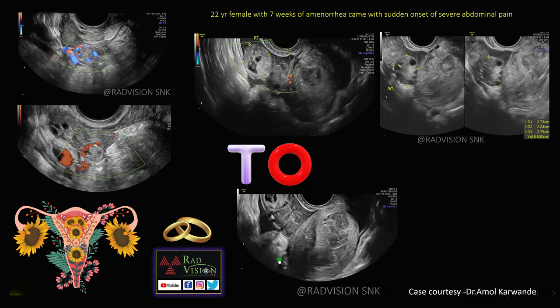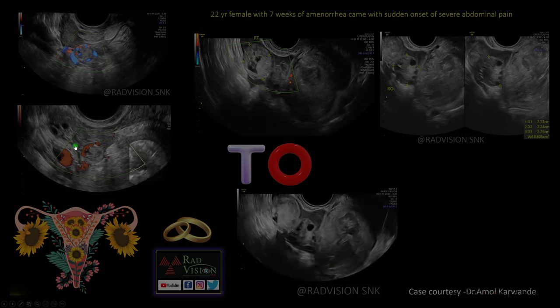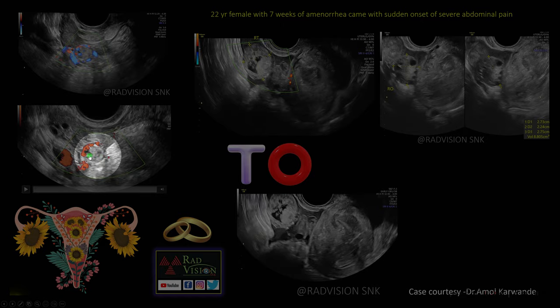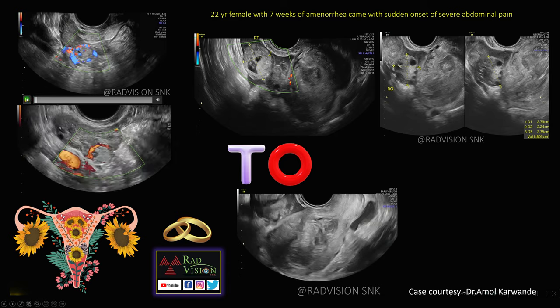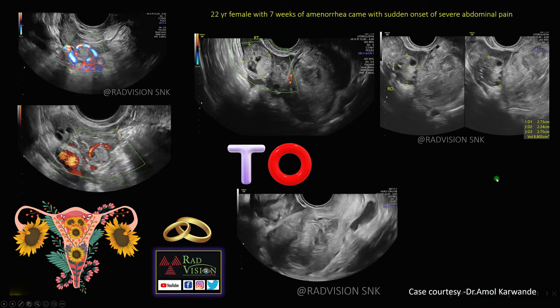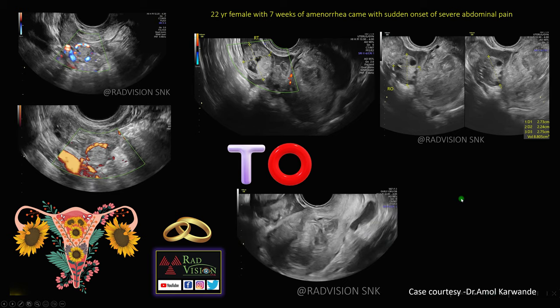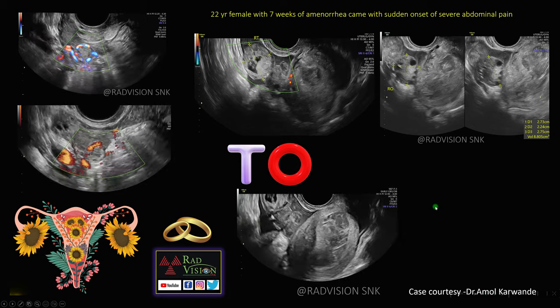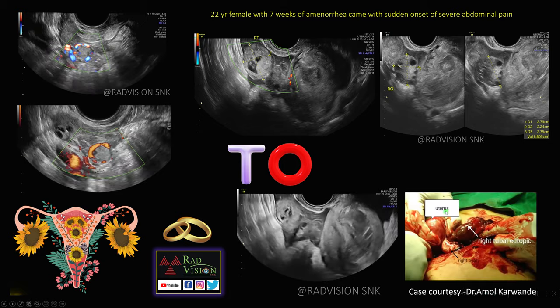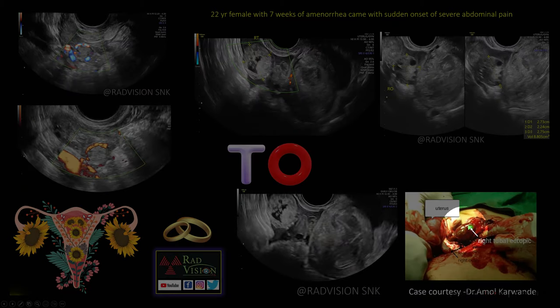This is also a case of right tubal ectopic where you can see an ill-defined gestational sac-like structure in the right tubal region surrounded by the tubal ring sign. Here I will play the video — you can see the tubal ring sign, also surrounded by ring of fire sign. Whenever you see an adnexal mass with tubal ring sign, definitely suspect ectopic pregnancy. This intraoperative film shows the right tubal ectopic, the uterus, right ovary, and right tubal ectopic.